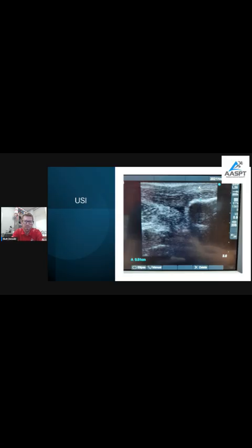Here's an image about 4 months in. It's pretty pixelated and it's from my cell phone, so I apologize for the quality here. But you can see on the right side of the screen, there is the Achilles tendon. You can see a dotted line that was measuring the thickness, labeled as A there. And at this point, my patient's tendon thickness had gone from 8 millimeters down to 0.51 centimeters. So it had tightened up quite significantly at that point.